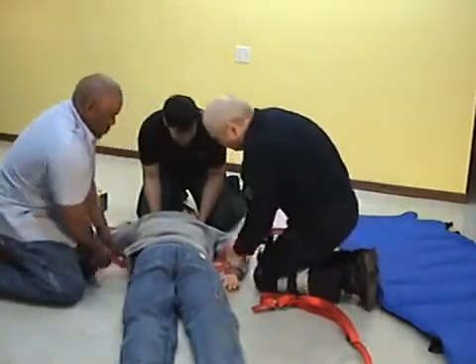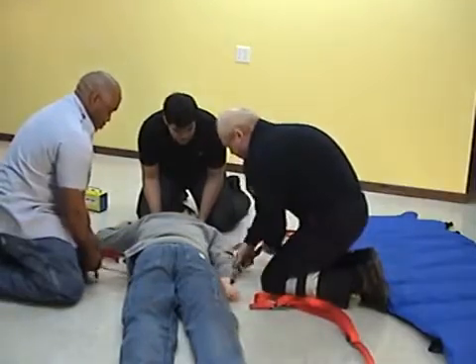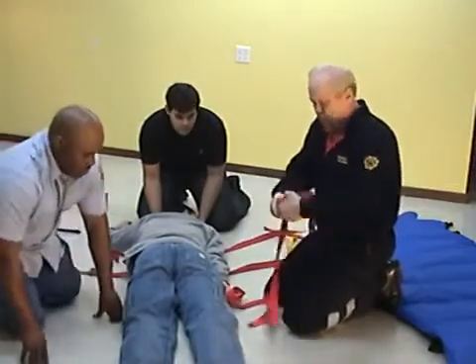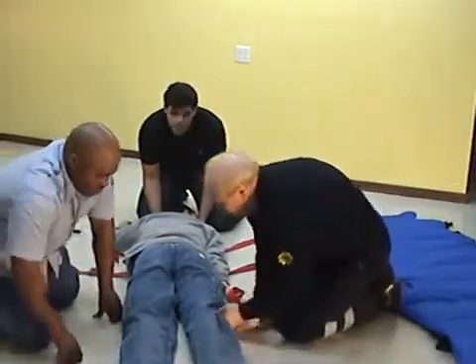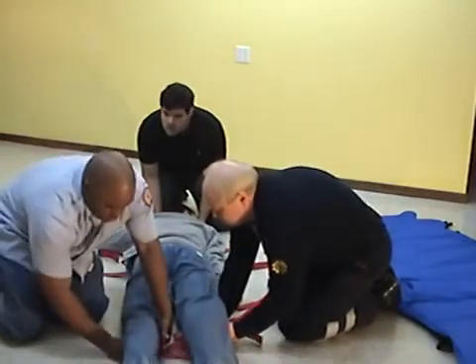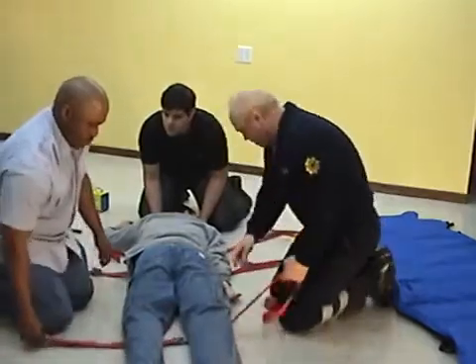The rescuer at the head of the patient, whom we'll call 'head,' directs the rescue. Head ensures that patient breathing is satisfactory. Attempt to apply a cervical collar if at all possible. Thereafter, head focuses on maintaining the position of the head as found.